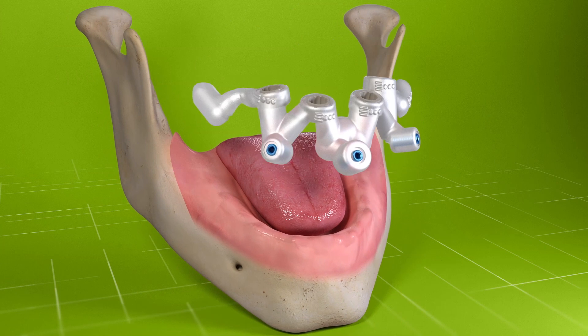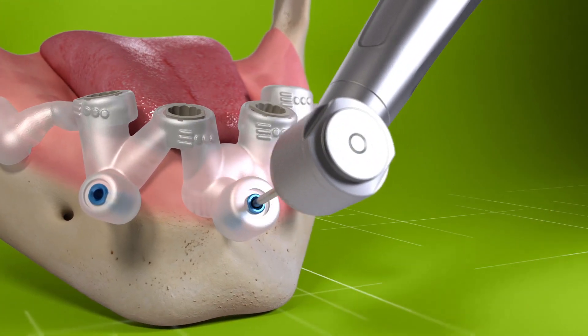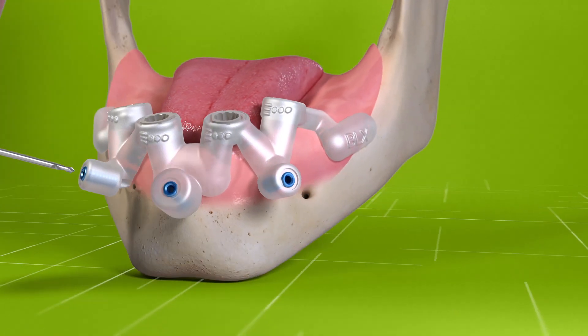Mount the template in the mouth and check for fit and retention. For edentulous cases, use lateral fixation to stabilise the guide.